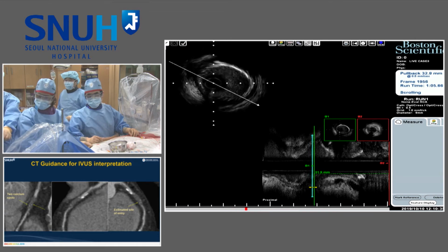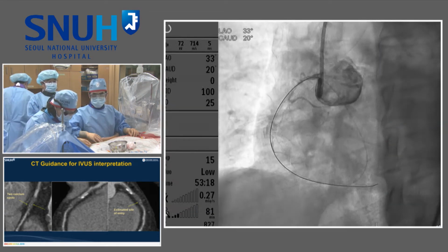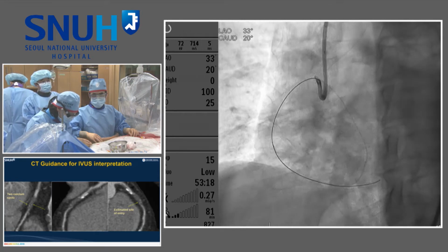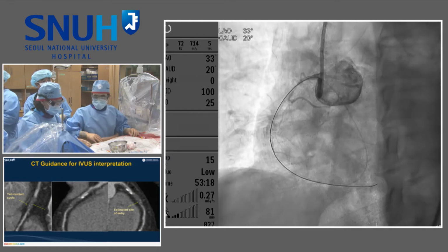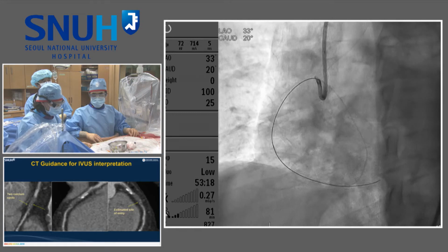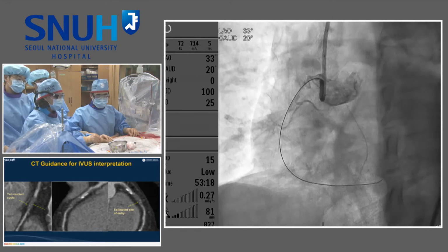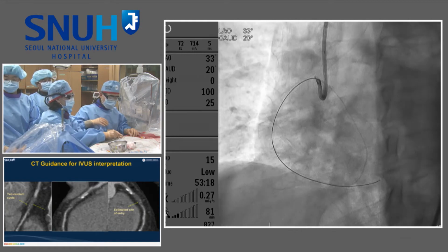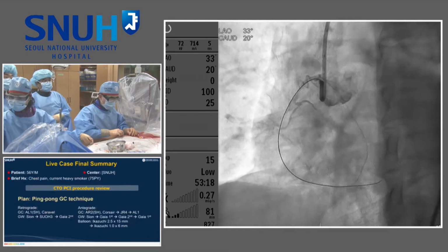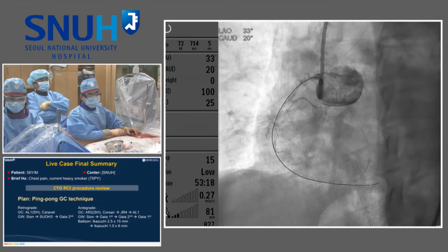Hi, Dr. Kim. Thank you for your teaching procedure. This is Kazuki Mizutani from Japan. I recommend to check up the channel injury before stenting. In this case, we do not do the externalization. So if channel injury occurs, we cannot stop the bleeding after stenting. Okay, so I try to make sure there is patency or no damage on the epicardial collateral channels. 잡았어?